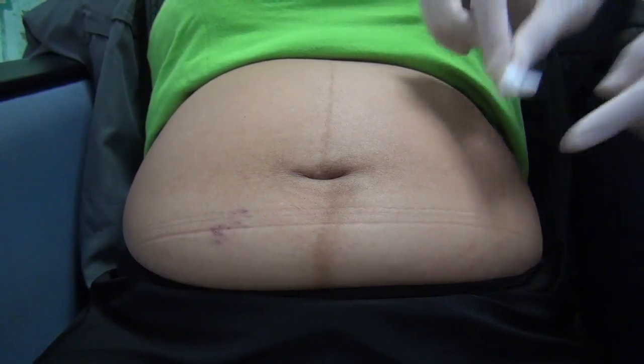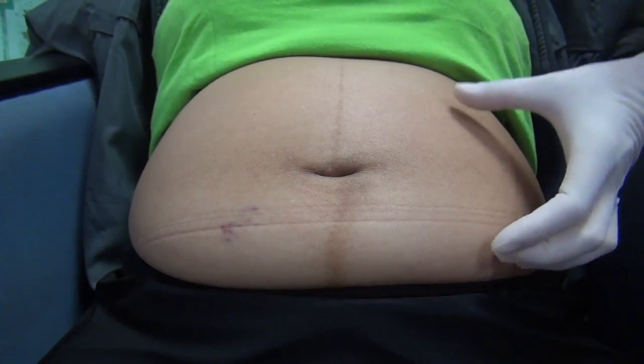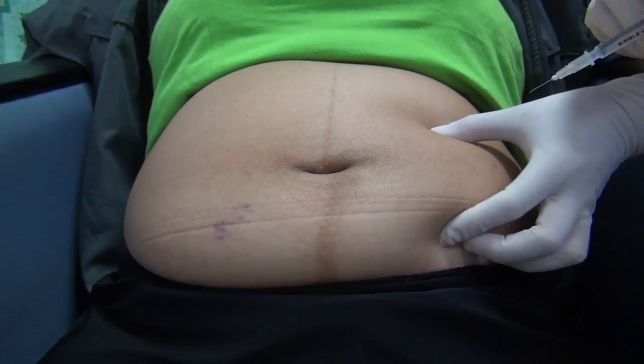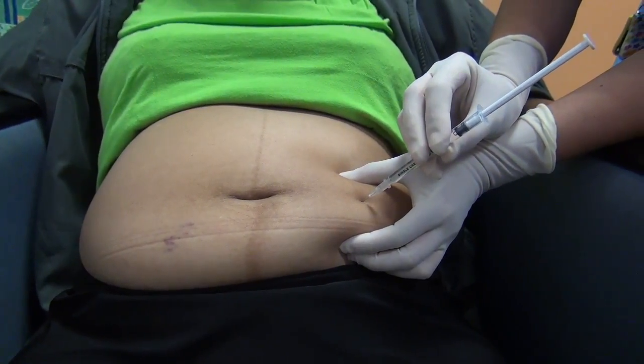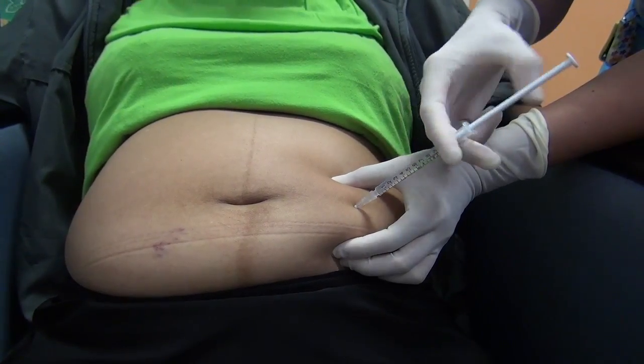Put on a pair of sterile gloves. Clean the site of injection with an alcohol swab and let it air dry. Uncap the needle. Pinch a fold of skin with your thumb and forefinger. This fold must be maintained throughout the injection. Next, insert the needle at 90 degrees into the skin fold. Administer the heparin by pressing the plunger with your thumb until the syringe is empty.